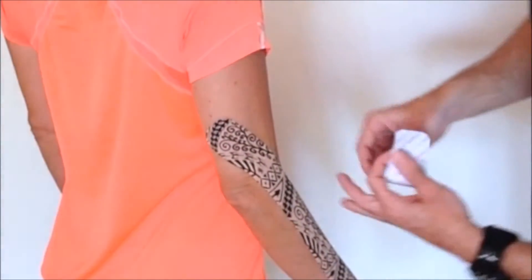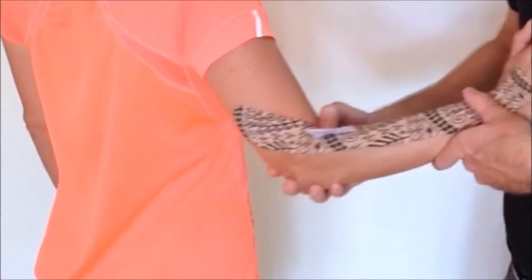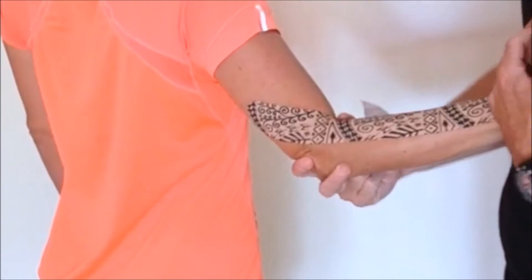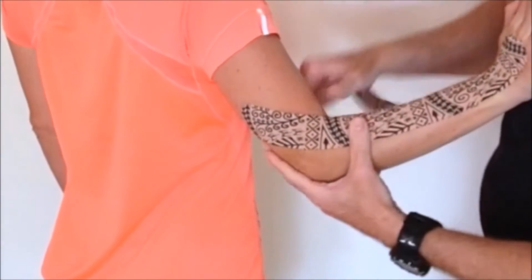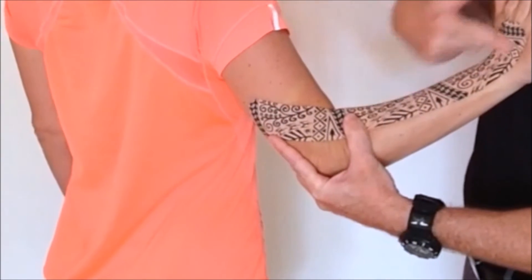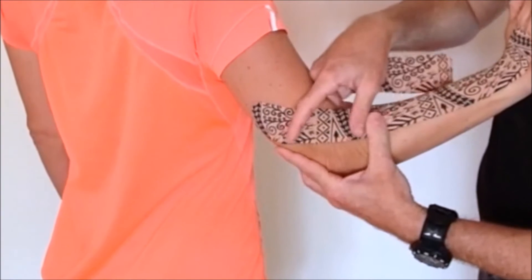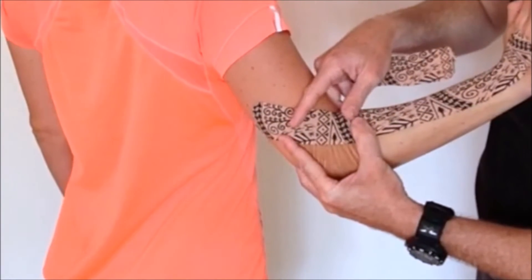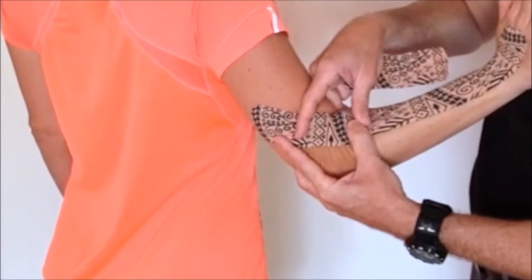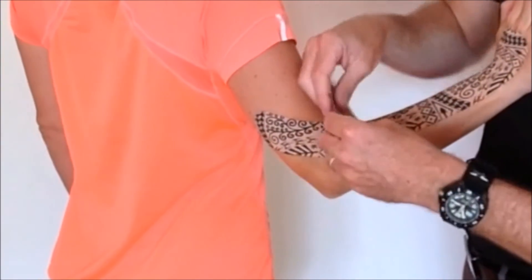The way that we do that is not to start in the middle — if we start in the middle, that makes it very, very difficult. We want the soft tissue in a short position so it's relaxed and I can really bunch it up nicely. So we're going to put the wrist and fingers in some extension to take the stretch off and allow me to box up all of this soft tissue, or even bending the elbow a bit to create some shortening on our brachioradialis as well.